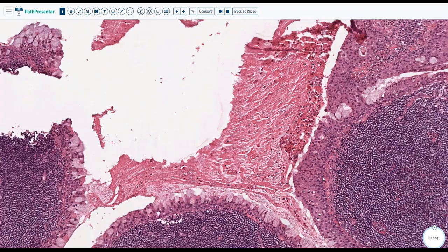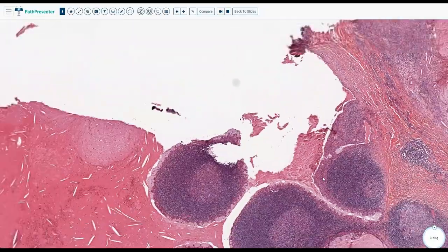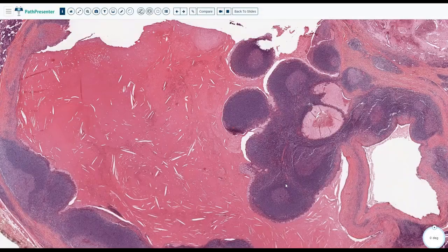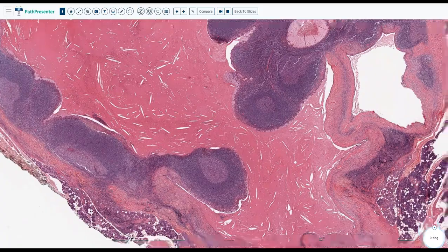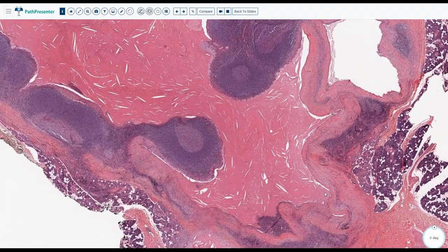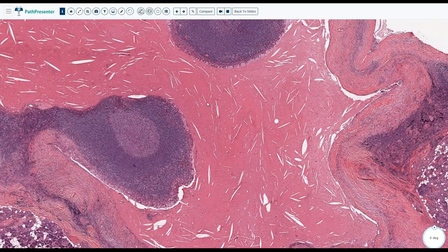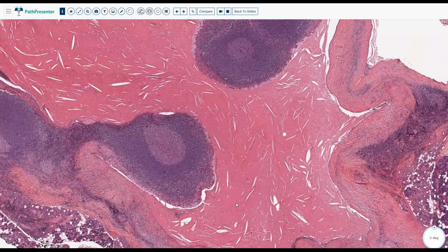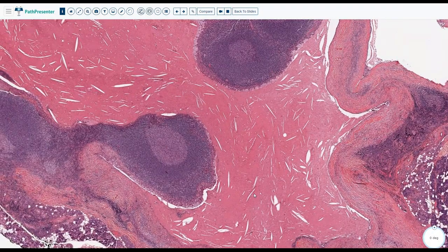Okay. Again, if you do a fine needle aspiration, it should be very nicely diagnosed. This is Warthin tumor. Grossly we see the cyst, and while aspirating it, it is like used car oil material, so it is a kind of dirty background in the fine needle aspiration, and this is characteristic for that. That's enough.